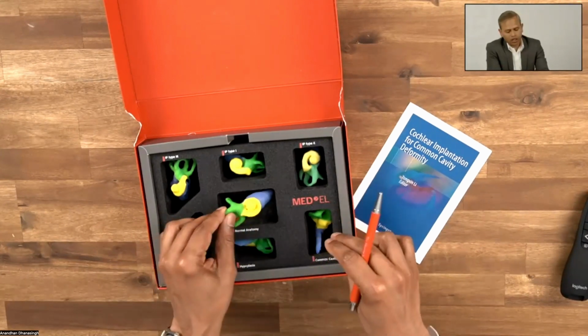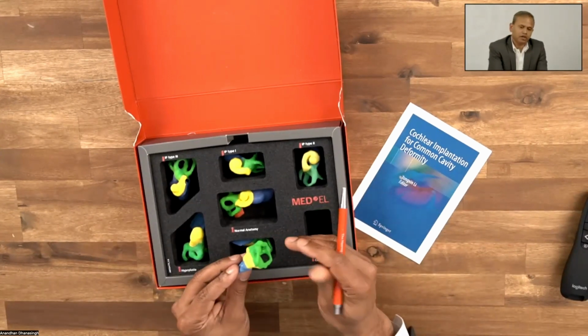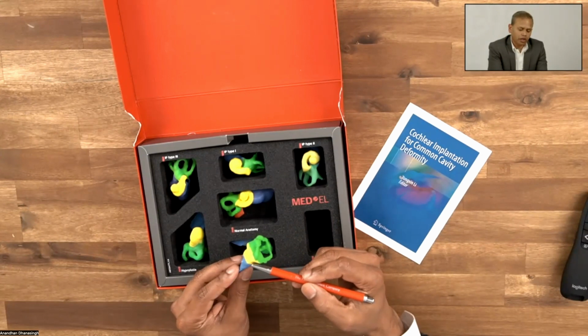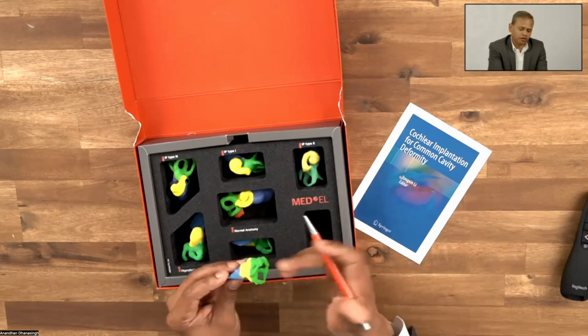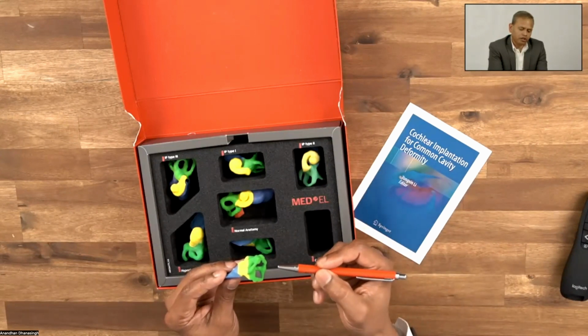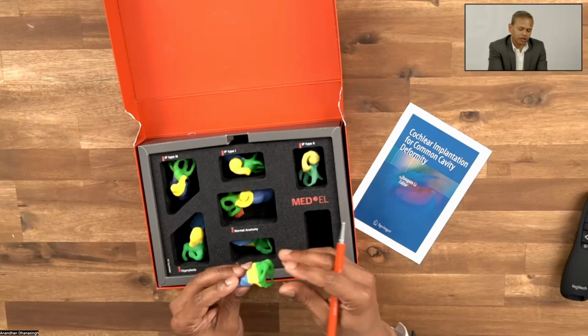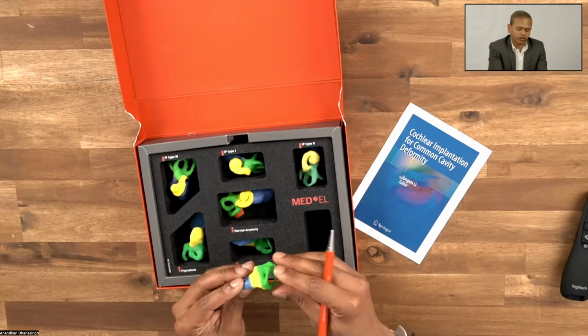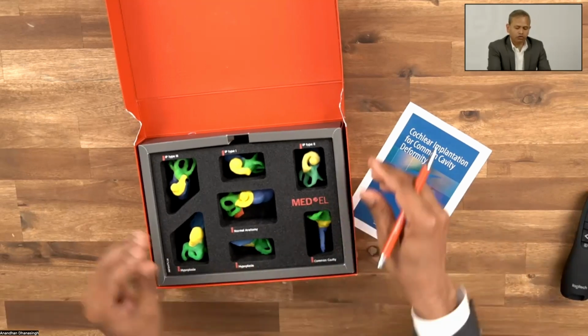However, in a severely malformed cochlear condition like the cavity type malformation, what you see here, where the cochlear portion is not well defined, how do we approach the inner ear for the placement of the electrode, and what could be the surgical complications during the electrode placement and also after the CI surgery? They are all questions.